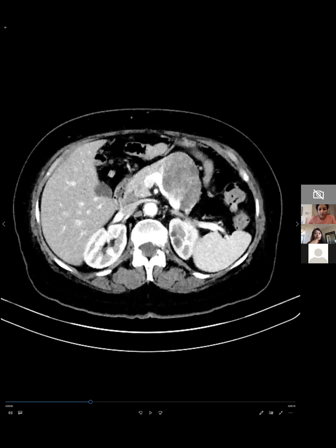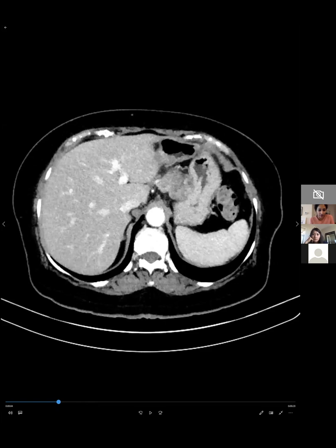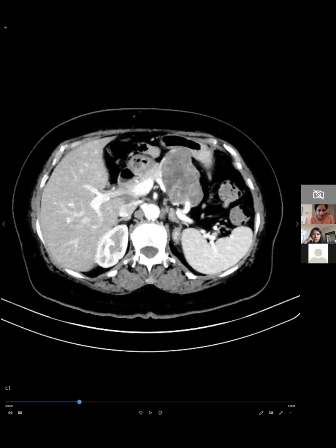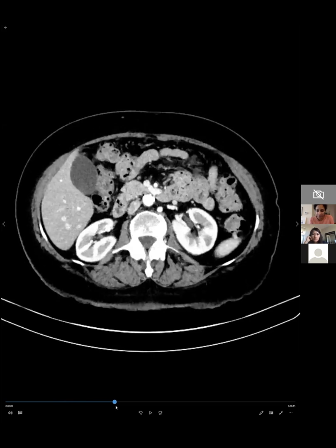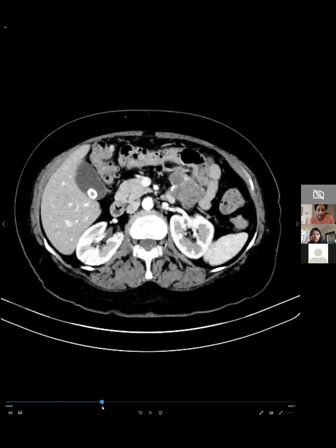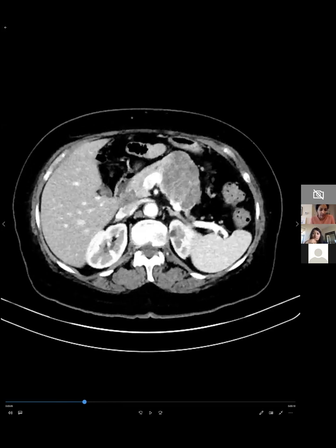Can we see? It's not hypervascular, but neuroendocrine tumors can invade the vessel. Right. Can you keep scrolling, please? Yeah, and Rupa has guessed a non-functioning neuroendocrine tumor, which I think is a great possibility. And then Alina said non-epithelial tumor. Other people say SPEN, and then someone said SPEN, but the age does not fit. Right. Yeah. SPEN, the age does not fit.